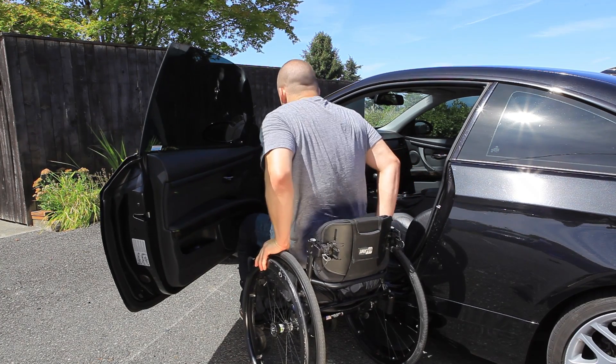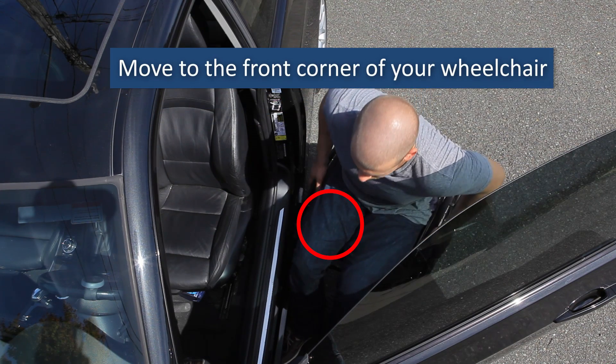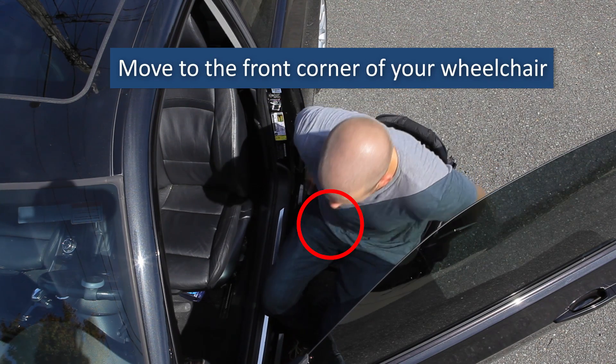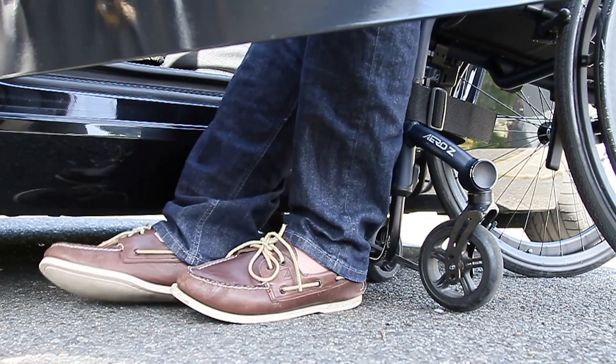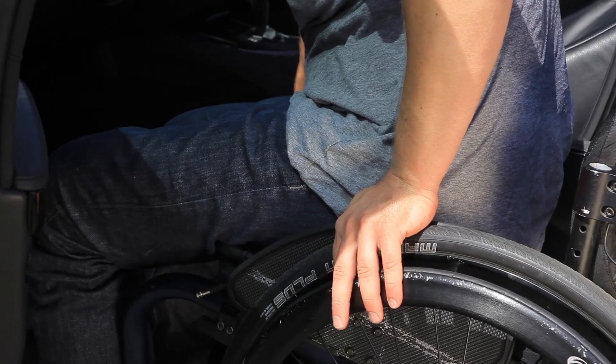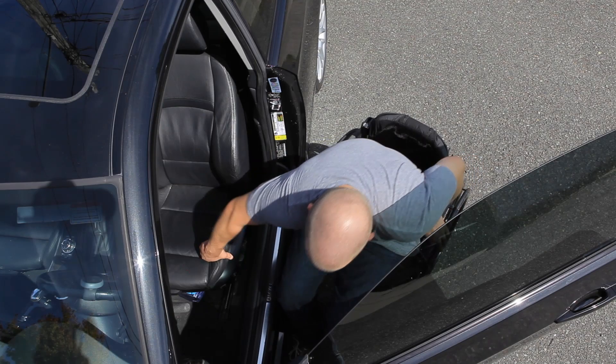Avoid positioning yourself too far forward. Move to the front corner of your wheelchair. If your wheelchair and car seat heights are similar, put one or both of your feet on the ground. Place your trailing hand near your hip, and position your leading hand on the edge of the car seat.